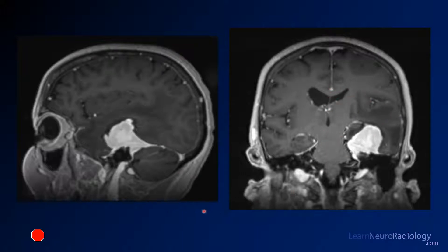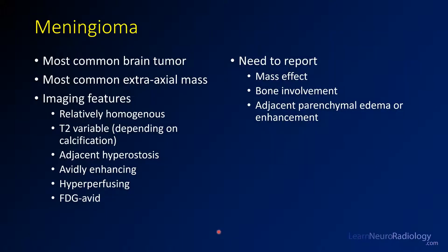As mentioned, this is a meningioma. Considering all brain tumors, it is the most common brain tumor overall and also the most common extra-axial mass. To recap imaging features: it's a relatively homogeneous mass that can be T2 bright or T2 variable. About 25% have calcification causing dark areas. Adjacent hyperostosis — new bone formation — is a useful clue. They tend to be avidly enhancing, hyperperfused, and can even be FDG-avid on PET. When reporting, note mass effect, bone involvement, and adjacent parenchymal edema or enhancement, as those suggest parenchymal invasion.